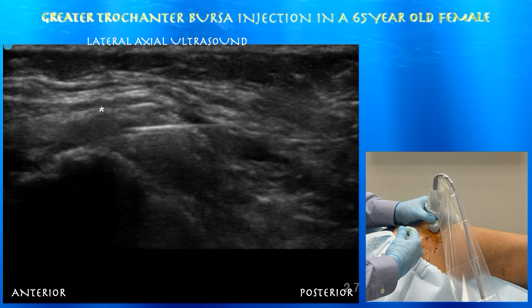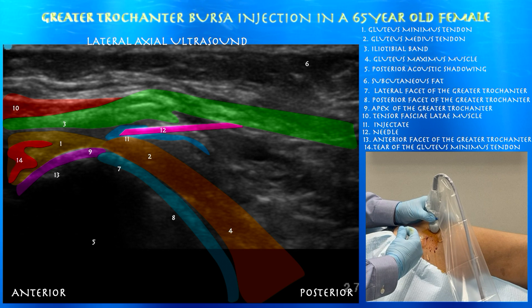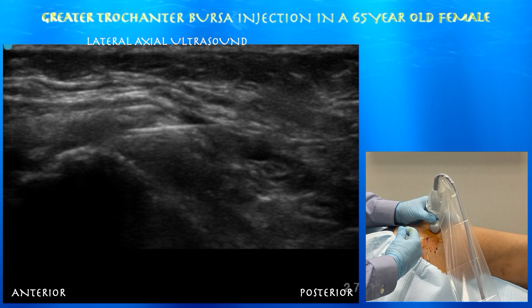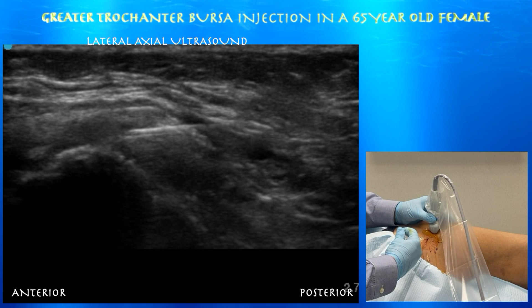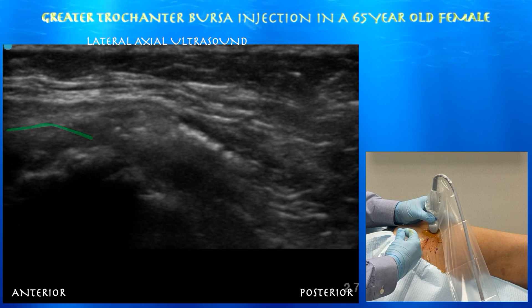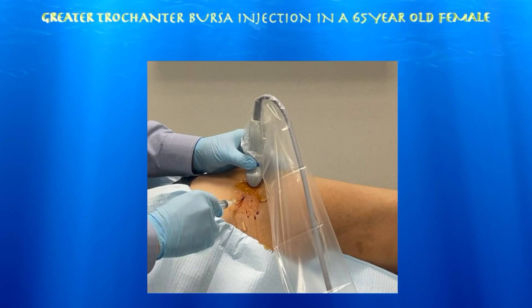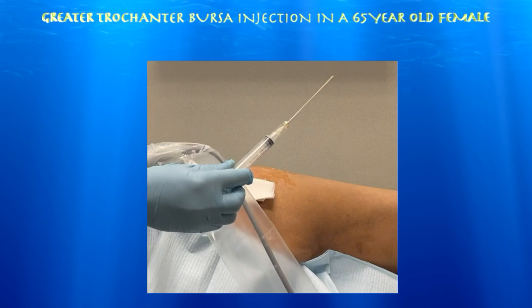This is going underneath the ITB, and we're trying to get it between the ITB and the gluteus medius tendon. You can appreciate that defect or tear within the gluteus medius tendon overlying the lateral facet of the greater trochanter. The margin or delineation between the gluteus medius and ITB is not so clear, but there is a subtle tissue plane between those two structures. Now we're pulling out, and here you can appreciate how long this needle is. You don't want to use a short needle where you won't be able to reach your target.